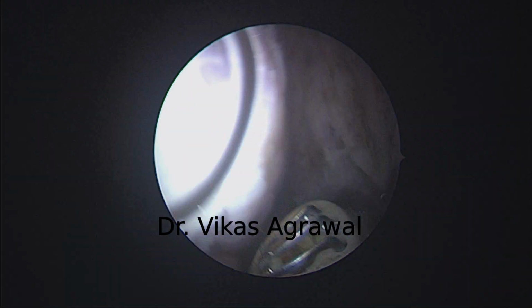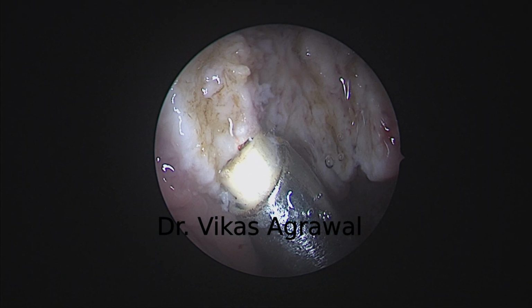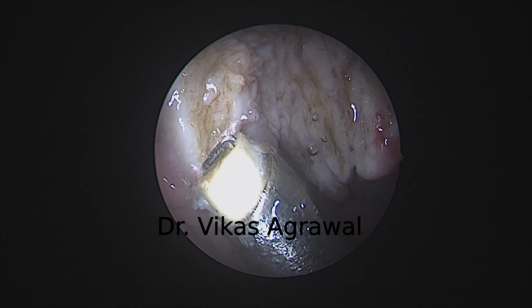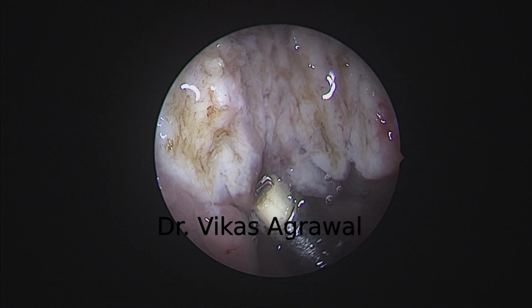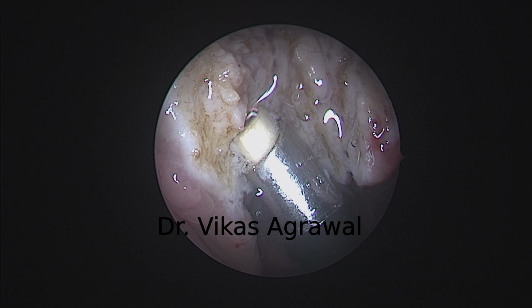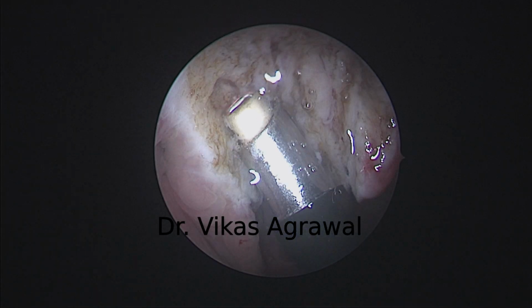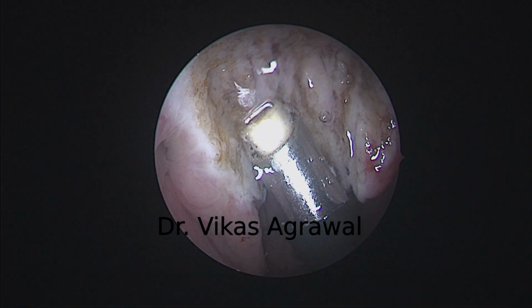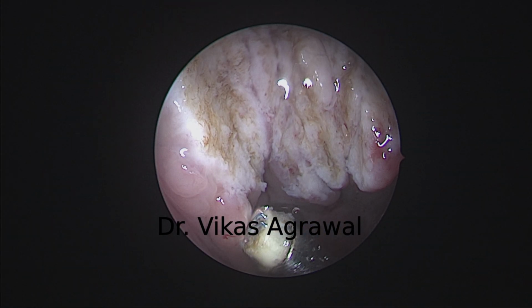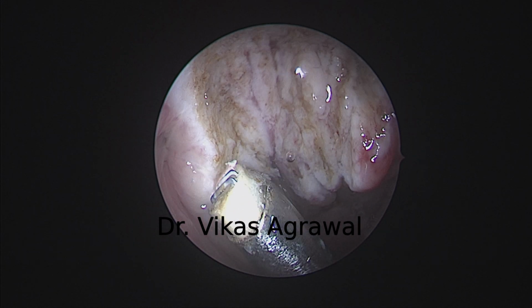So that there is no scarring of the orifice, but all this lymphoid tissue submucosally I am removing completely, so that we can give the chance for the best healing of the chronic ear issues that the child has without cutting open the eardrum.